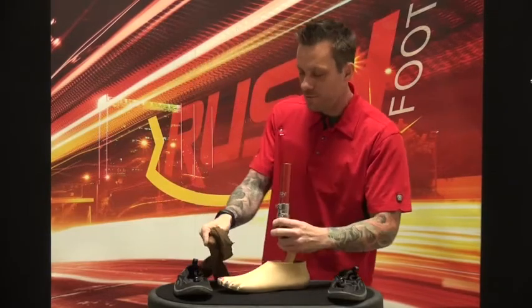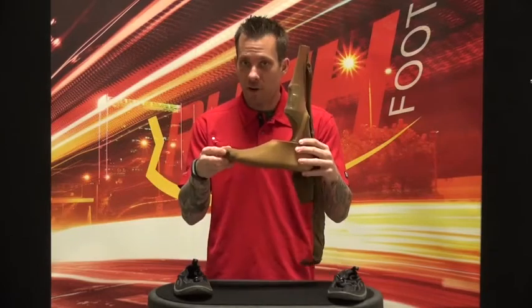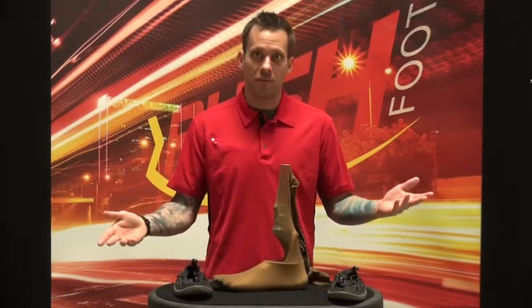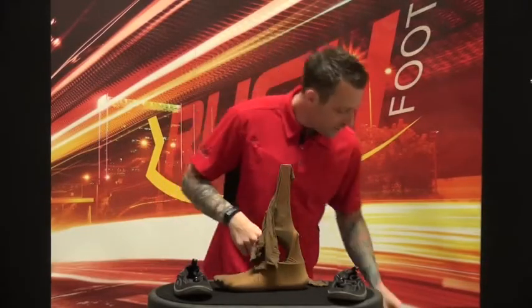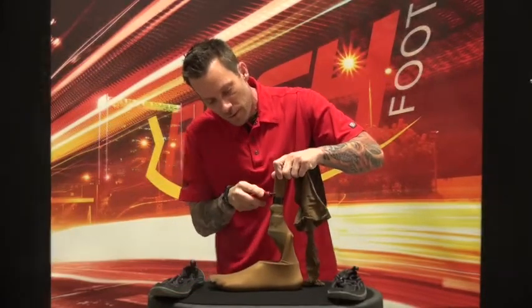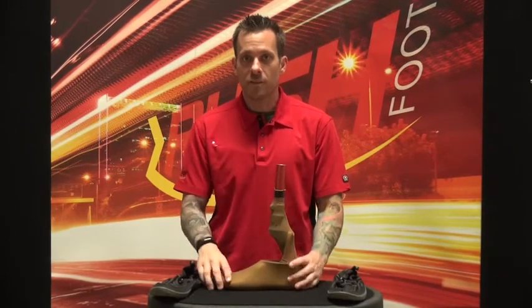Well, other than wear them like I would on a normal Saturday night, I'm going to go ahead and put this over my foot. There we go — I've got my pantyhose over my prosthetic foot. You're probably wondering what the heck I'm doing, other than looking fantastic. I'm going to take a piece of tape, wrap it around the pylon here, and trim off the excess, just so I only look slightly ridiculous.